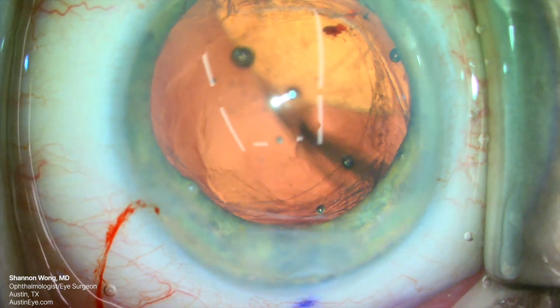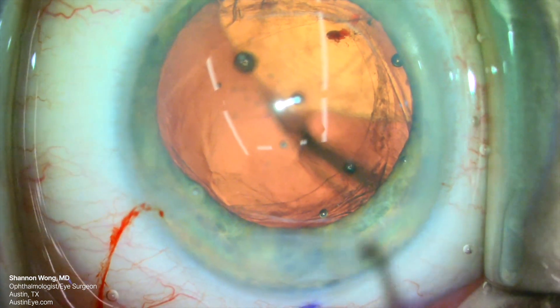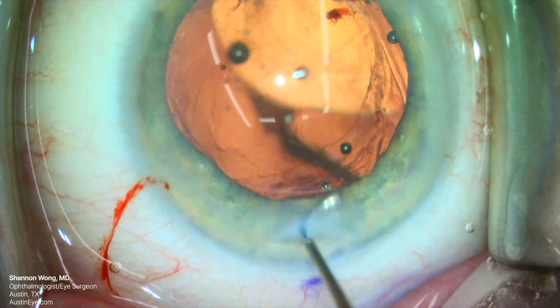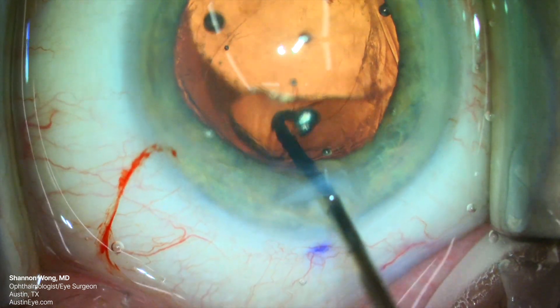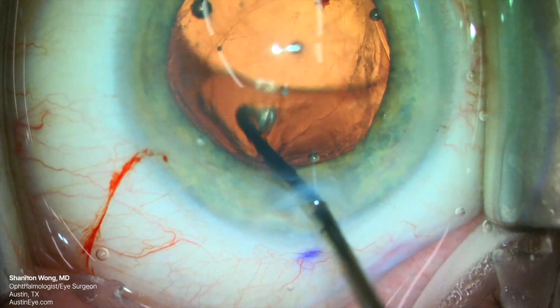Now we get to solve a problem that we created. The lens implant has just dislocated into the vitreous from our infusion. We have maybe a minute before the PanOptix lens falls to the retina.